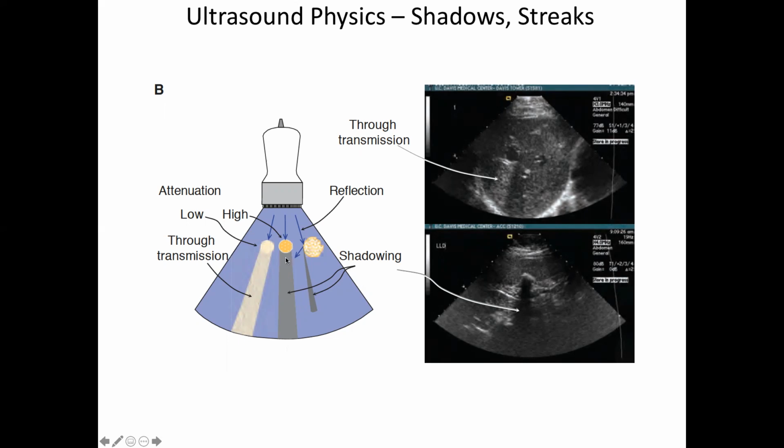And I would say this is probably the most common thing that gets in your way when you're looking at ultrasound images. There's something there that's casting a shadow that you have to try and work around. But because it's real time and you have the thing in your hand, a good tech sees an artifact like this and doesn't keep that picture. They just keep moving and find a picture that can get around that artifact.